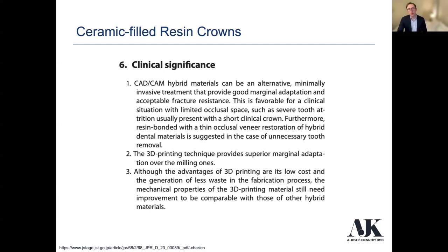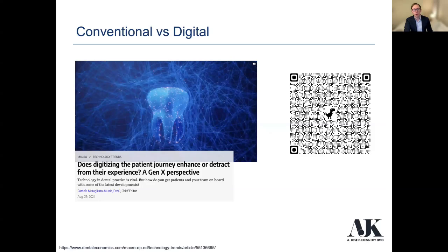This is a little shaky, I'll admit, but in this article, the research suggests that that is the case. And then we know that the advantages of 3D printing are its low cost and less waste in the fabrication process. The mechanical properties still need improvement to be comparable to those of other hybrid materials. So when we think about conventional versus digital, again, many of us are using technologies that have changed dramatically in the past decade in our practice.